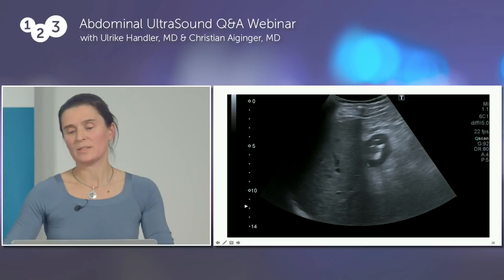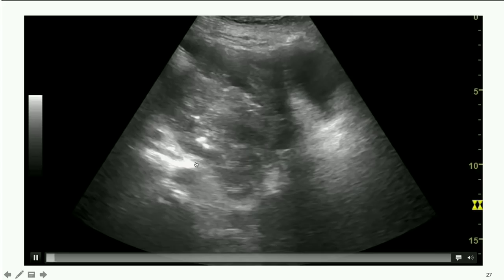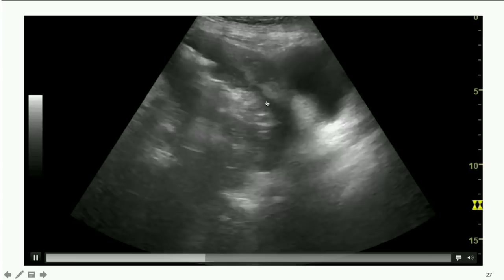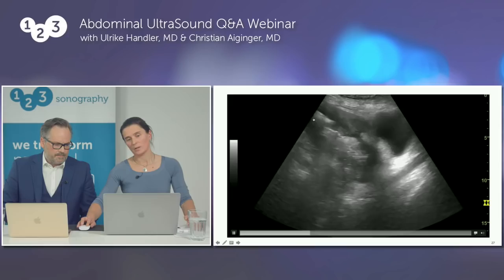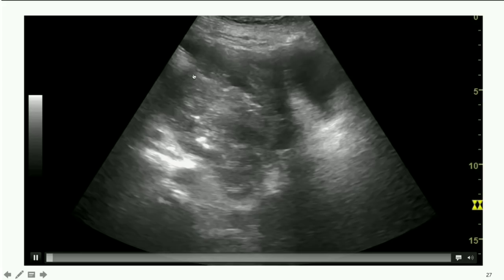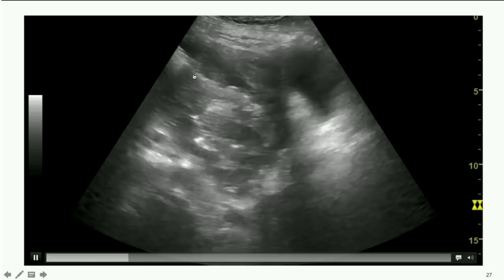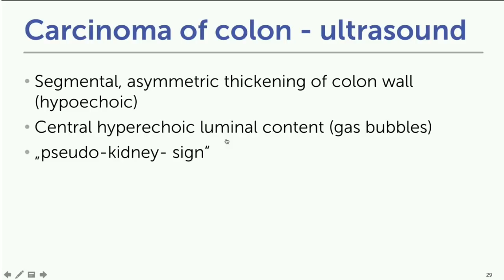Here is another case of a large carcinoma — it appears to be in the sigma-rectum region. Following it cranially, you can identify the sigmoid colon. In this longitudinal scan the urinary bladder is shown for orientation, and right cranial and caudal to the urinary bladder there is this large carcinoma with gas bubbles in the center and tremendous thickening of the wall, which can cause intestinal obstruction.